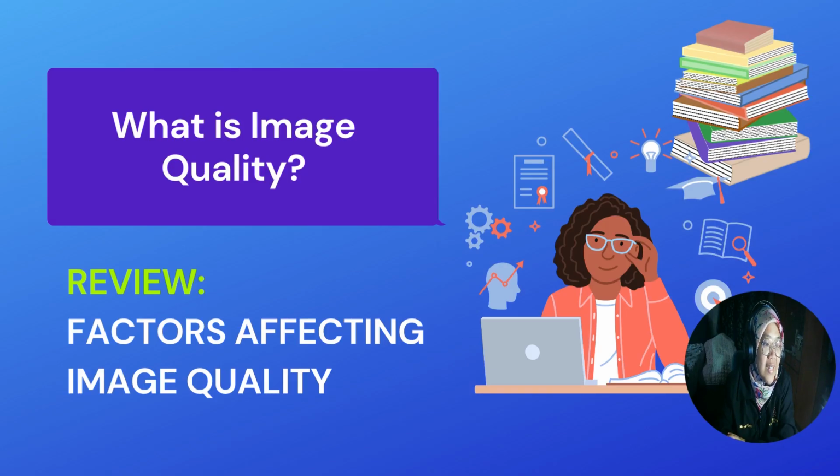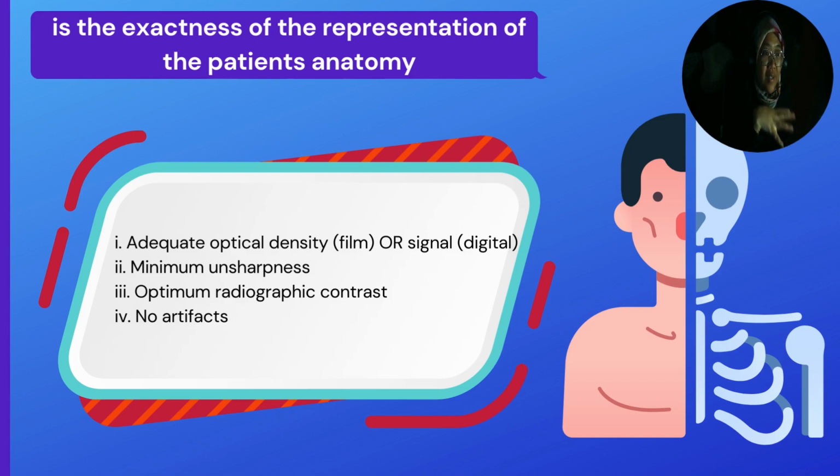So what is image quality? Review factors affecting image quality. Okay, it is the exactness of representation of the patient's anatomy, with adequate optical density in film or signal in digital, and minimum unsharpness, optimum radiographic contrast, and no artifacts in the image.